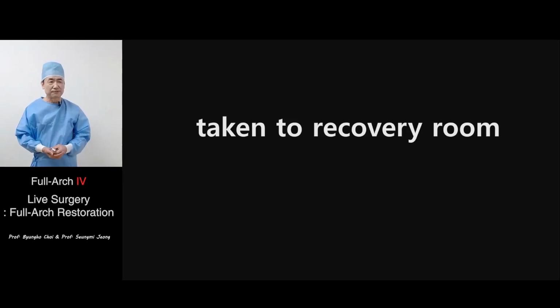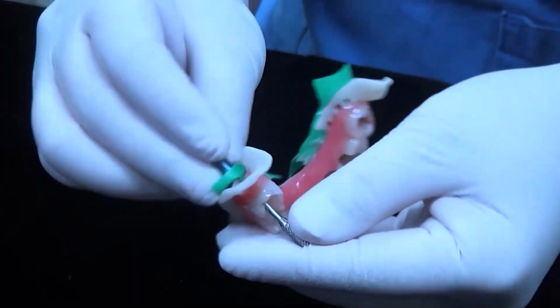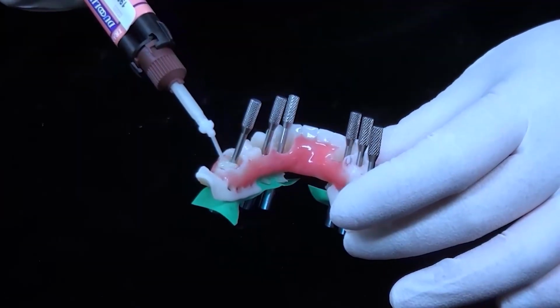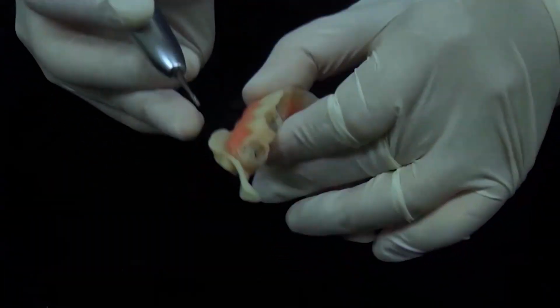The patient was taken to the recovery room after the operation. And then we start the laboratory work, converting the provisional denture to the provisional fixed bridge.